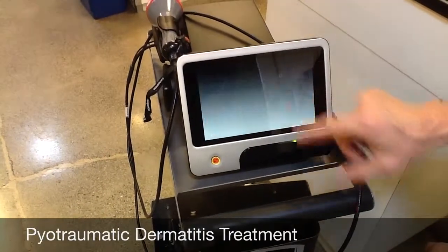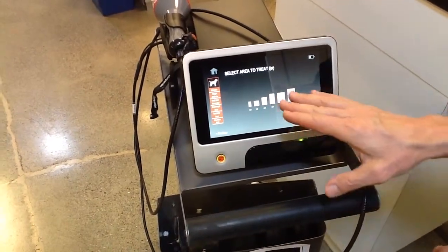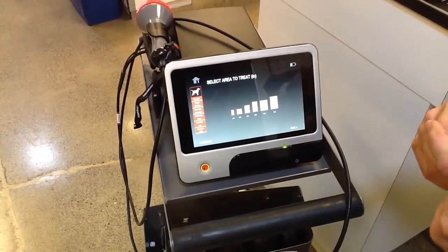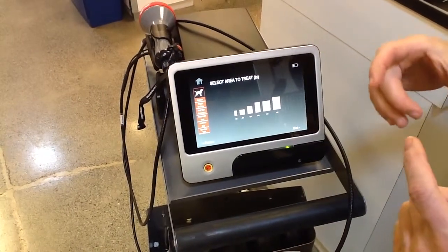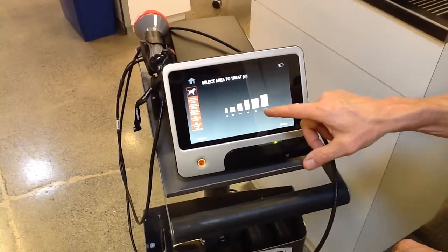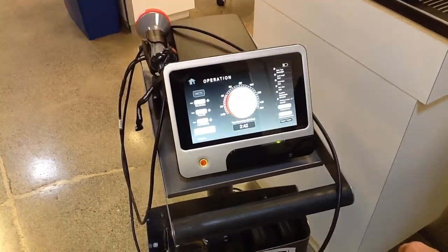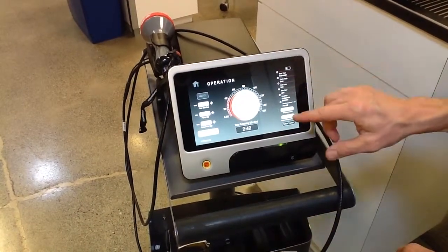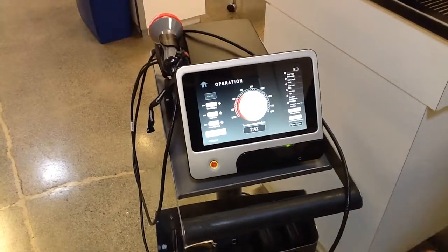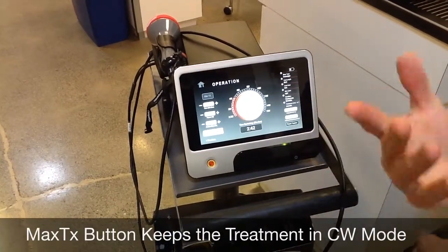Let's show you pyotraumatic dermatitis — this applies to any kind of dermatitis. You get a graph of the area you want to treat, measured in inches. Remember: this is not just the wound size but the wound plus the normal-appearing tissue beyond the margin. So if you had a wound that was 2 by 3, you might pick a 3 by 4 or 3 by 5 treatment area, then hit next. The laser will tell you the treatment — for example, 432 joules for that area, which makes sense: 100 square centimeters at 4 joules per square centimeter is about 400 joules.